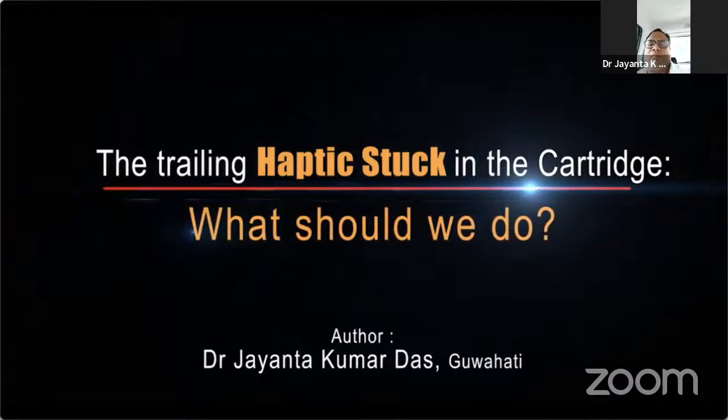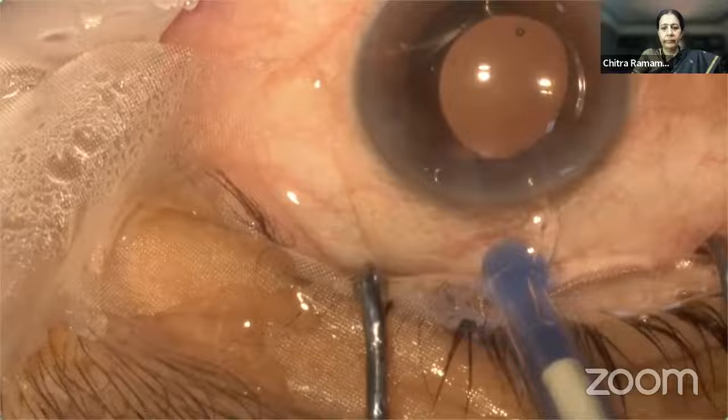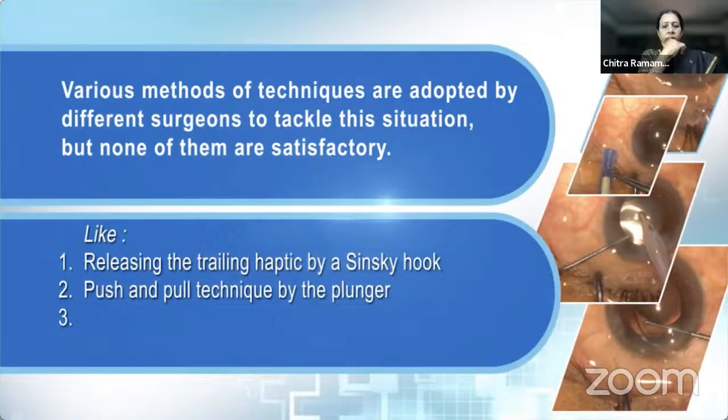The trailing haptic stuck in the cartridge — what should we do? Once the trailing haptic is stuck inside the cartridge, it should be released without any damage to the haptic for a successful outcome of the surgery. Various methods and techniques are adopted by different surgeons to tackle this situation, but none of them are satisfactory.